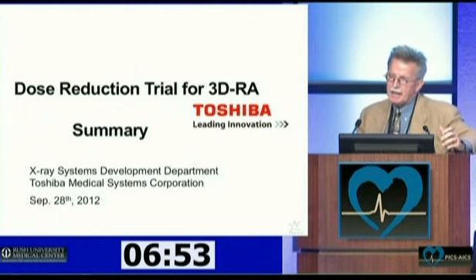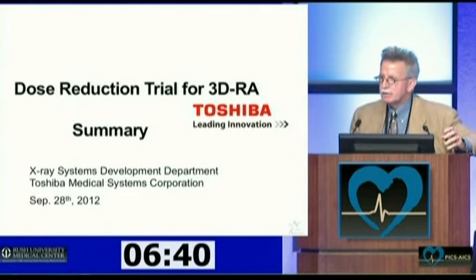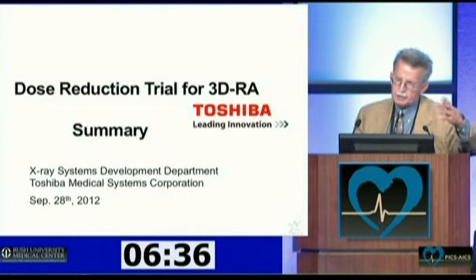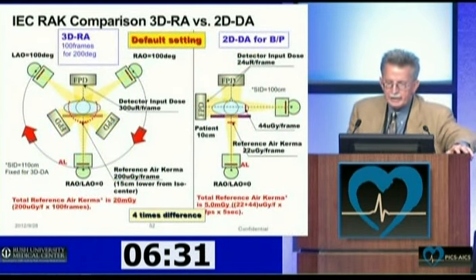But one of the only times that we always do digital acquisition is in 3D rotational angiography, because that's the only mode that it's set for. You have to do digital acquisition. We've given a charge to the engineers: we want to try it in fluoro record and not digital acquisition, so we can really knock the dose down during that time. And Lee already talked about the dose compared to the conventional biplane angiography.